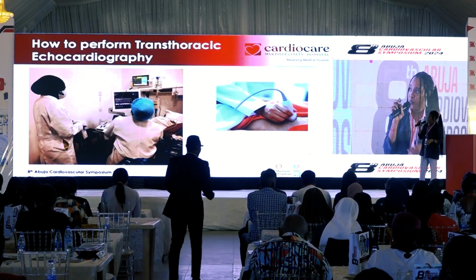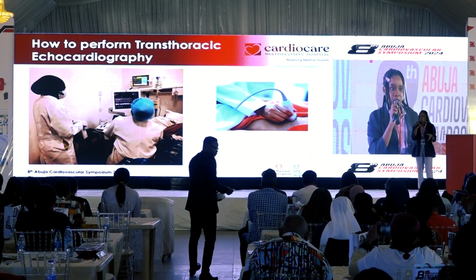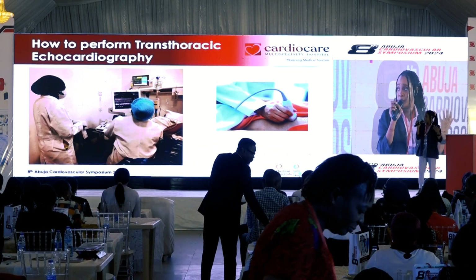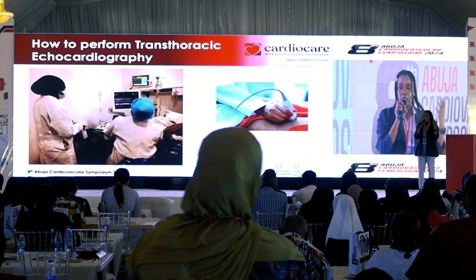So this is just me and my colleague performing echocardiography for one of our patients. And this is pretty much easy. So they come in, we explain the procedures to them. We tell them, oh, we need the upper part of their body exposed, and we tell them, oh, this is what to expect, this is not what to expect. They go and lie on the bed.